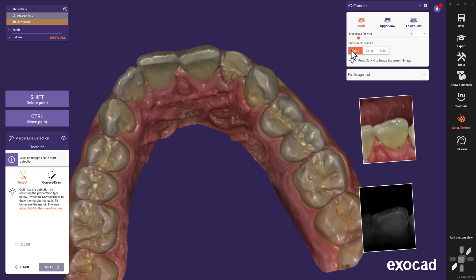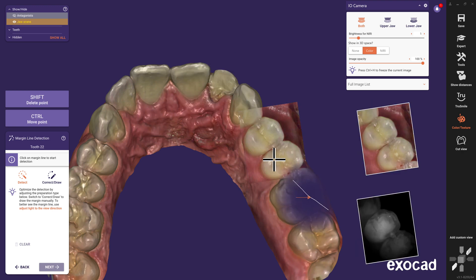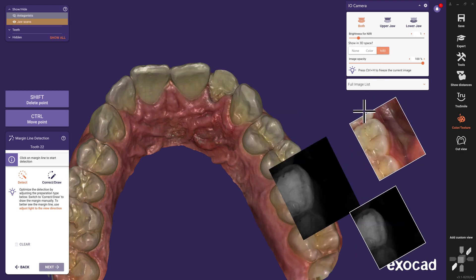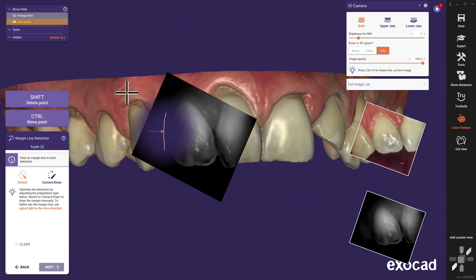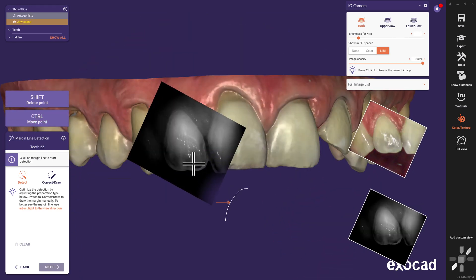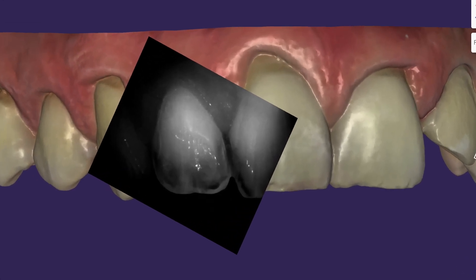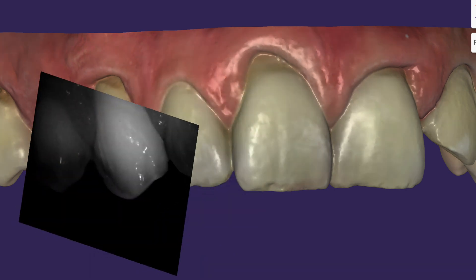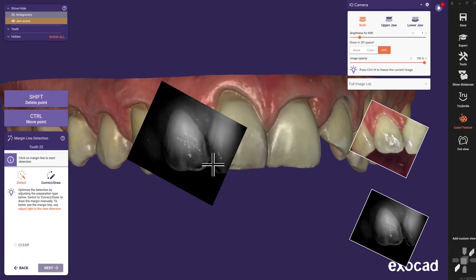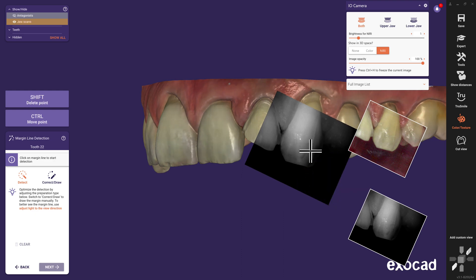Of course, a great option is the ability to show in 3D space. Now you can overlay the color or Niri picture to any point across the 3D model if the angle is available in the recorded data. Using this technology, it is possible to visualize the tooth structure, particularly the enamel and dentin. Also, the translucency of the adjacent tooth and the stump color is displayed in high resolution.